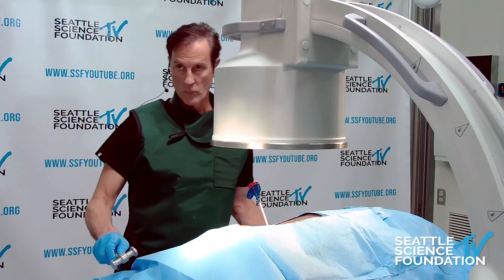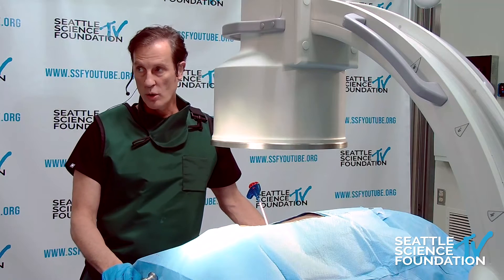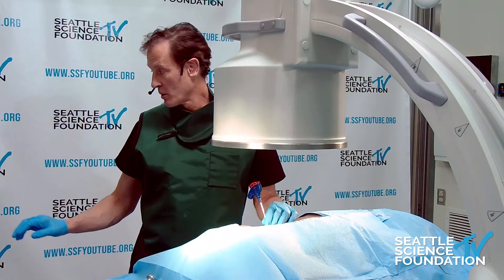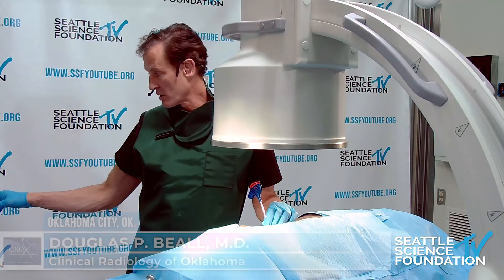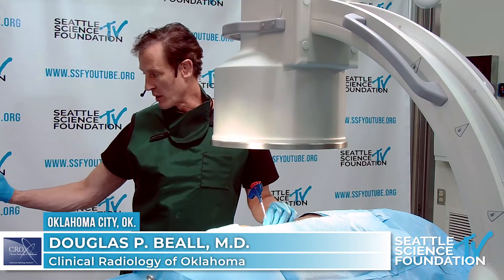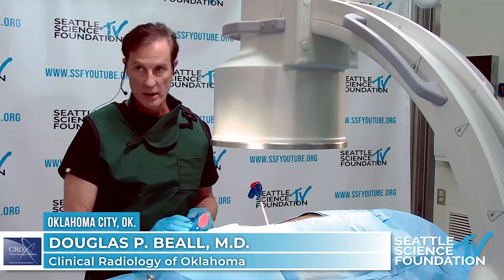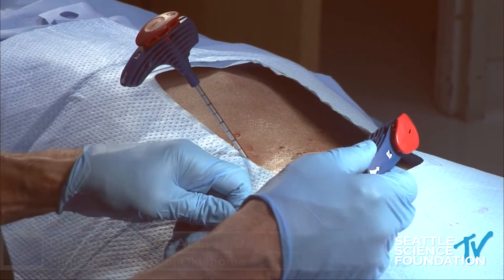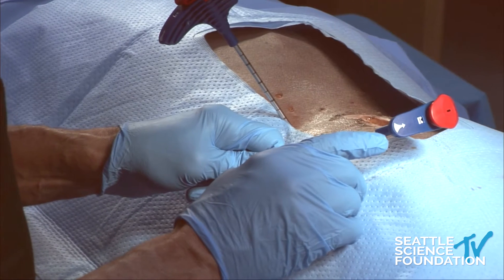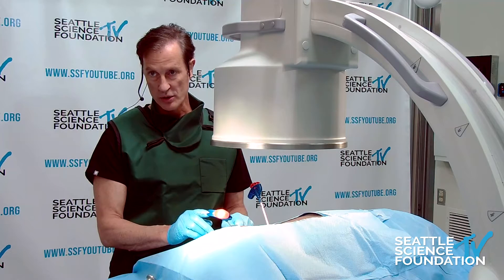So we've got the basal vertebral nerve ablation, and this is made by Relivant. This needle has a directional arrow indicating the direction of the nitinol stylet, and we have the existing stylet.